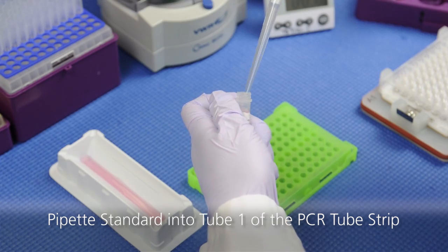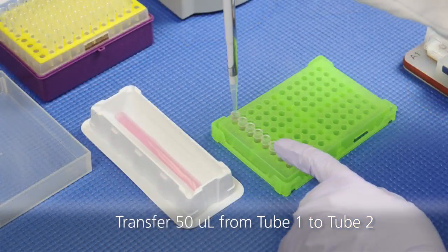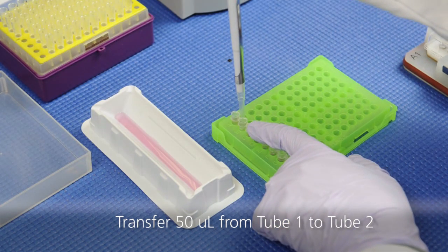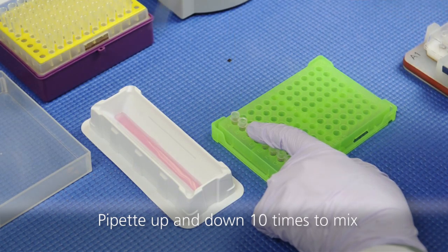Pipet the contents of the antigen standard into tube 1 of the PCR tube strip. Transfer 50 microliters from tube 1 to tube 2 and mix by pipetting up and down 10 times.